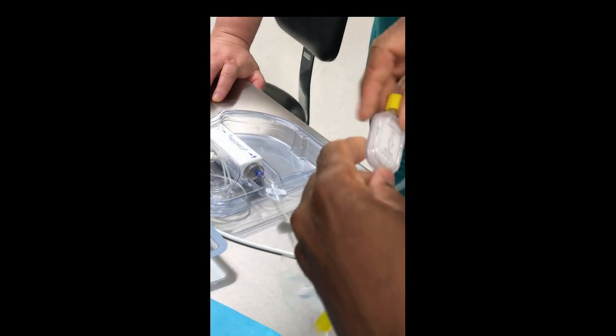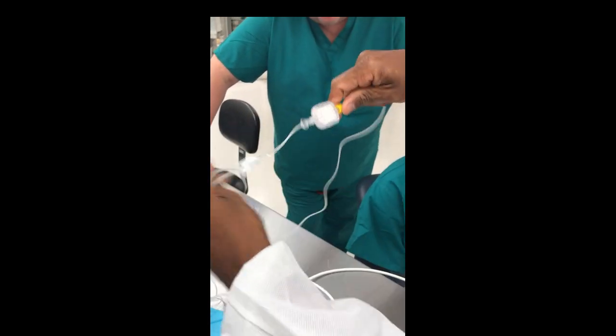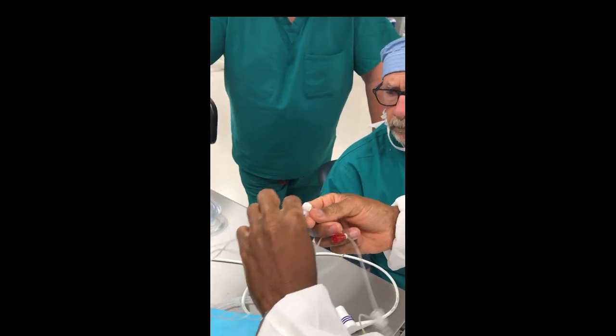First, make sure this connection is tight because sometimes it's loose. Notice the color-coded connections — red to red and yellow to yellow.